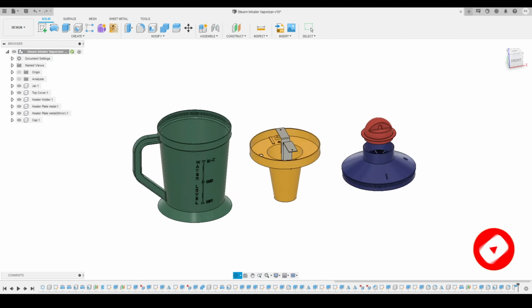So now I'm going to start designing the handle for this jar. So I will start with a sketch. I will turn on the canvas to see how the shape of our handle is. Now I will turn it off and I will just go back to our sketch. Either I can go on to this sketch and edit this sketch, and I can start adding the handle shape. So this we can do inside this sketch as well. So I will go on to create panel over here and activate our line tool. Here you can see this is my line tool, and I will start creating a shape of my handle.